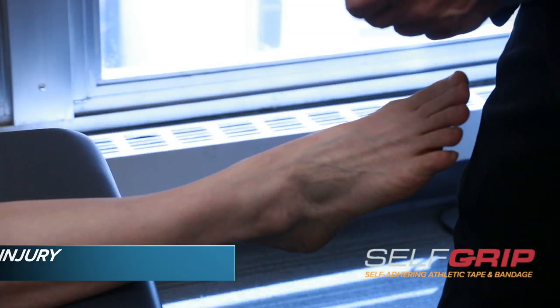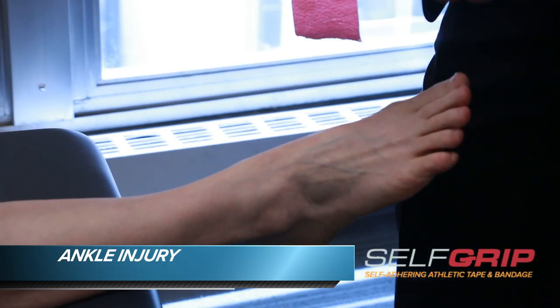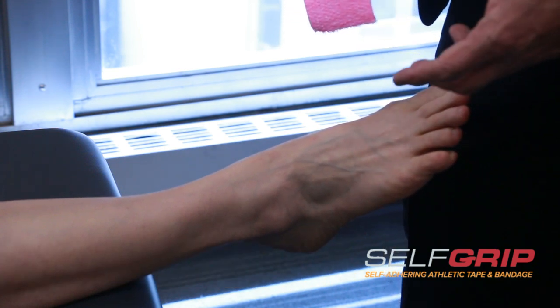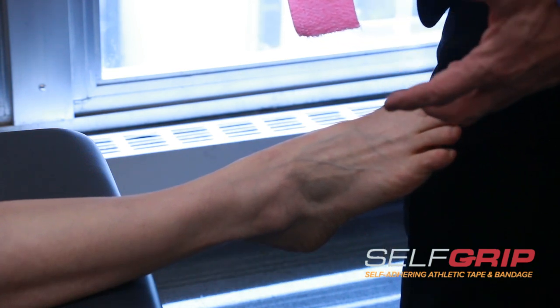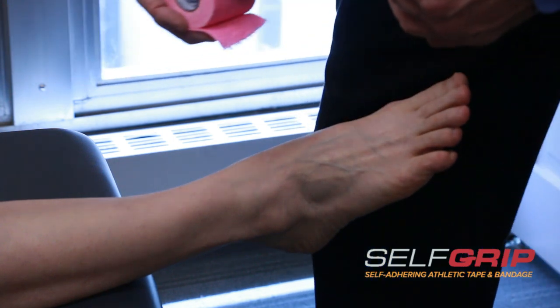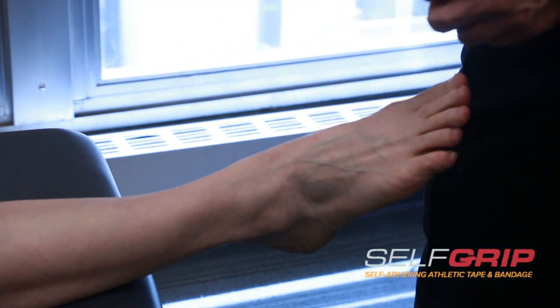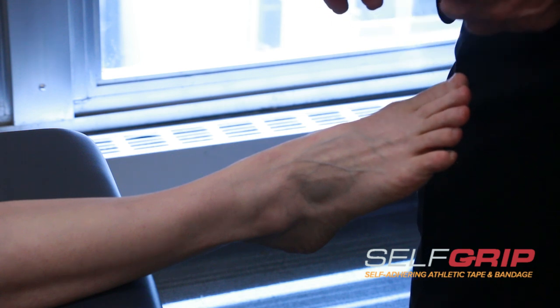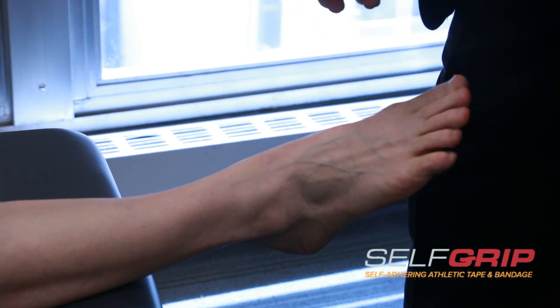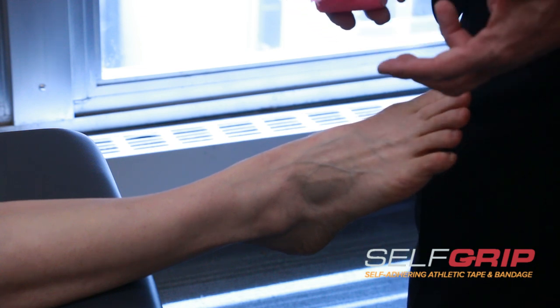Now we're going to tape Sue's ankle. Ankle injuries are among the most common injuries that we utilize taping procedures for. We've all seen athletic trainers on professional teams using the white tape that goes up the ankle, but self-grip actually does a remarkably good job at supporting an ankle that's got a minor strain or sprain. Of course, a severe injury needs to be seen by a health professional and treated appropriately, but for a minor strain, nothing is better than self-grip.